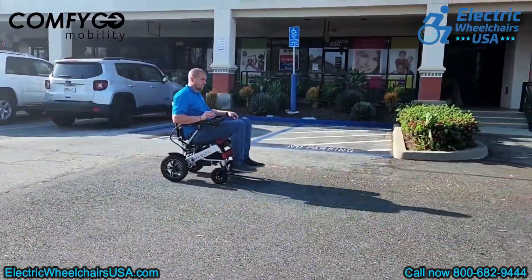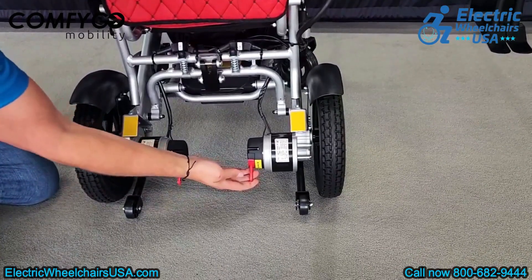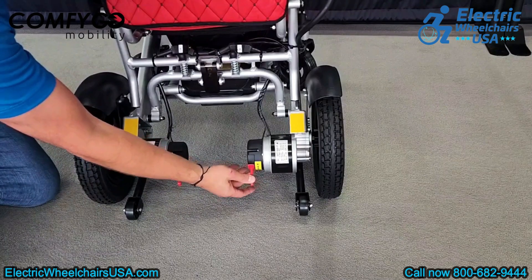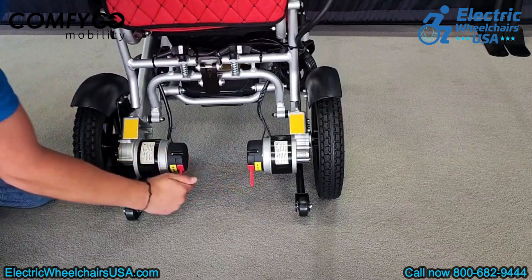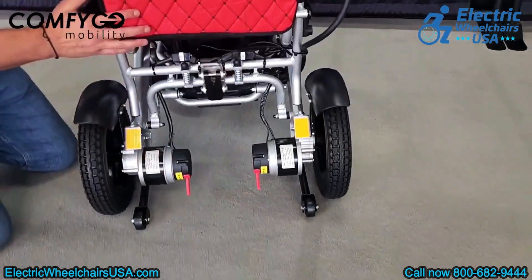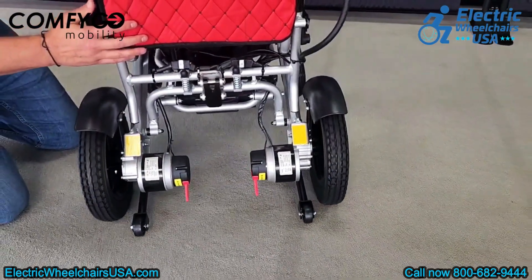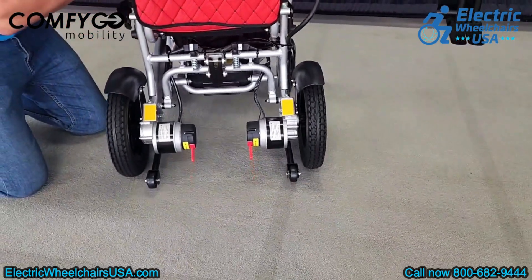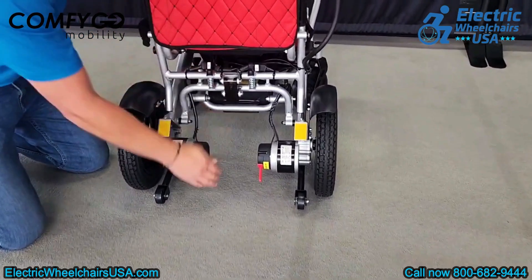There are two red levers on the chair. When both are pressed down, they switch the chair into freewheel mode, turning it into a manual wheelchair that can be pushed. This is handy in case the battery runs out, allowing you to push it to a charging point. Remember, you won't be able to use the chair in powered mode when it's in freewheel mode, so you'll need to push both levers back up to resume driving.